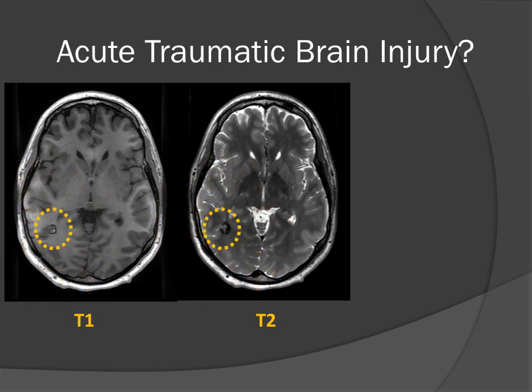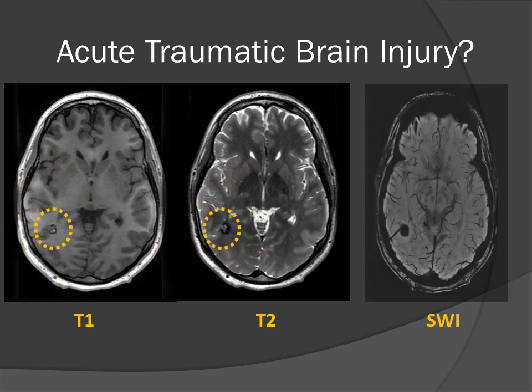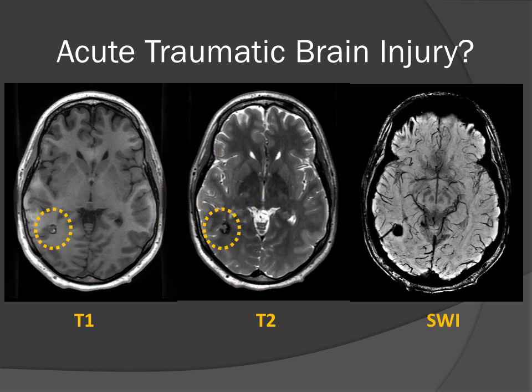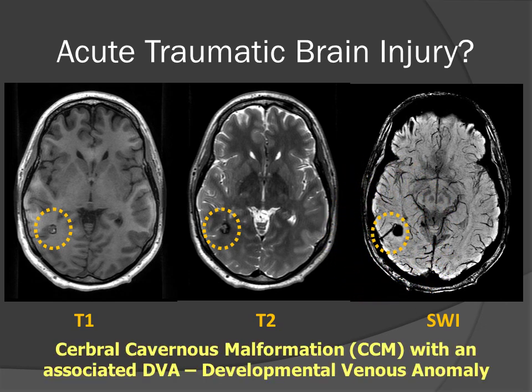When we do the susceptibility-weighted image, we see a linear structure coming off the edge of this rounded mass. This, therefore, is most likely going to be a cerebral cavernous malformation with an associated DVA or developmental venous anomaly.